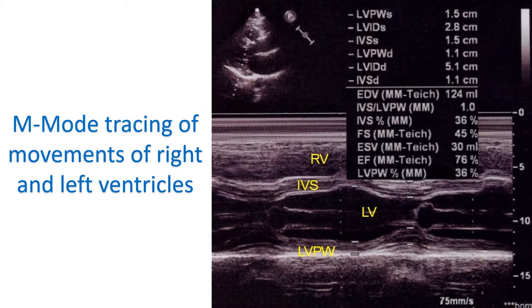This is an example of an M-mode echocardiogram of the left ventricle and part of the right ventricle — the lower chambers of the heart. M-mode echo is mostly used for a quick measurement of left ventricular function in a busy echo lab, though there is much more information which can be gained from it. Most operators are becoming less familiar with M-mode with the availability of more advanced modes of echo.